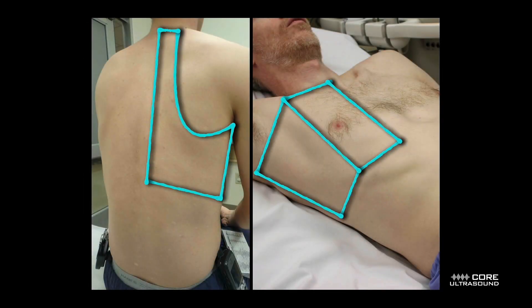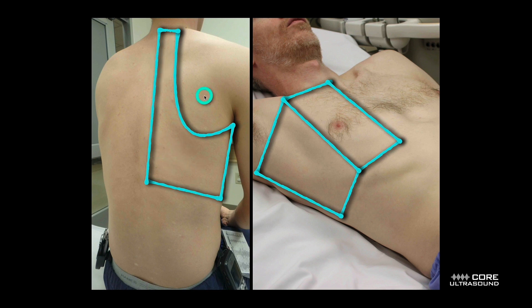As far as where to scan your patient, what I usually do is divide the patient's lungs into basically three zones per side: anterior, lateral, and posterior. This posterior area is probably the most important — most pneumonias are going to be in the lower lobe, which is represented back here in this area.